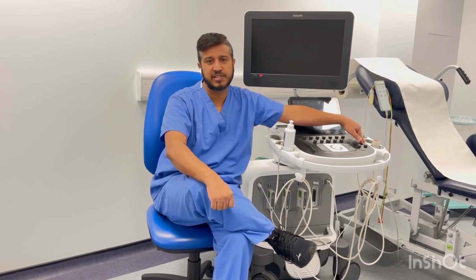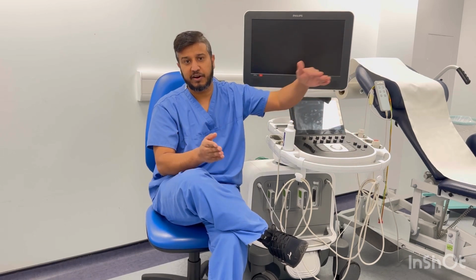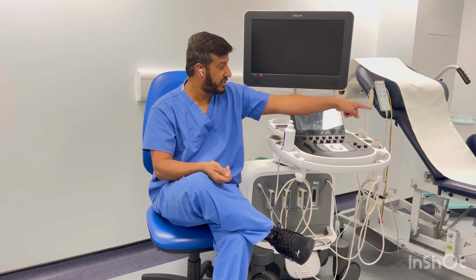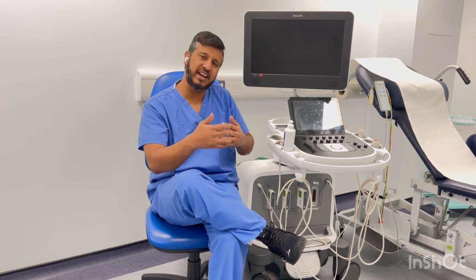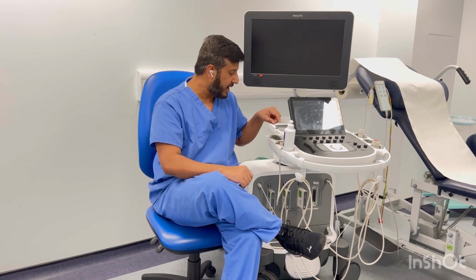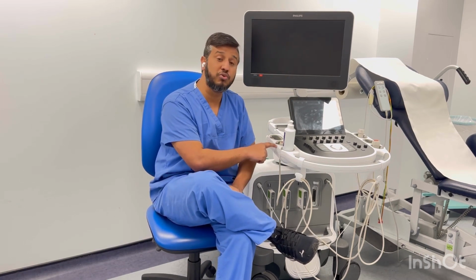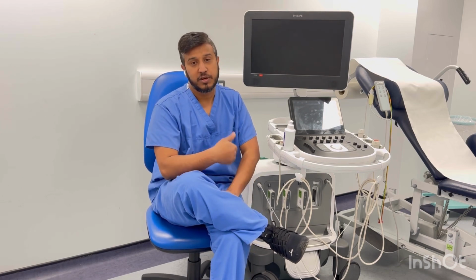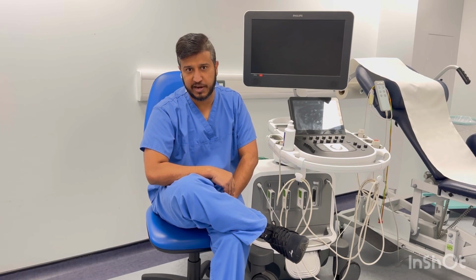There are different probes on different machines, but the frequency should be around that. It will be written there. Then the pediatric probe goes 8 to 10, and if your patient is an infant, you are going to use the S12 probe. So as the frequency goes up, your penetration goes down.